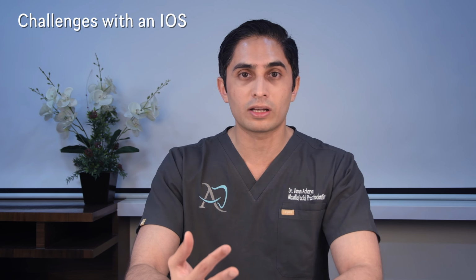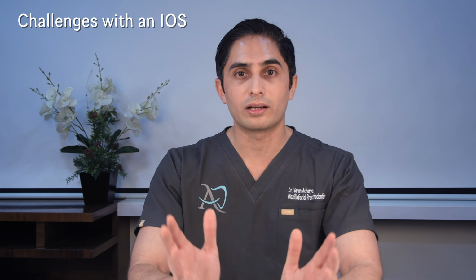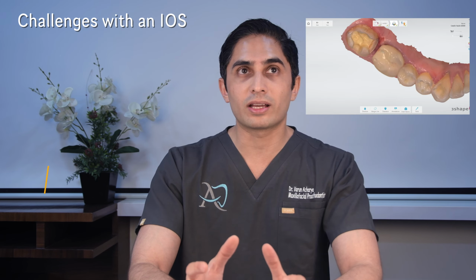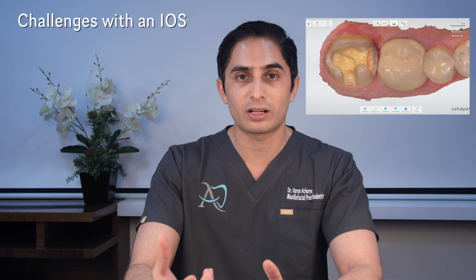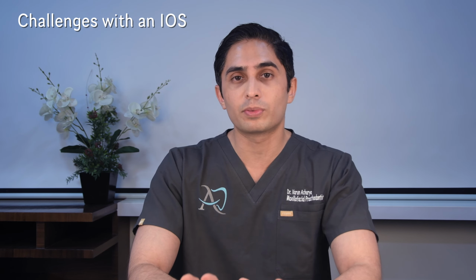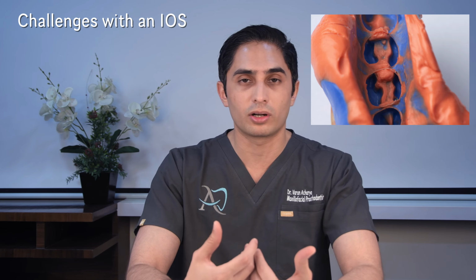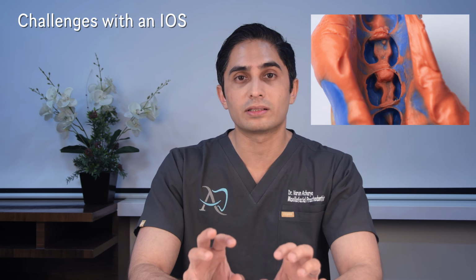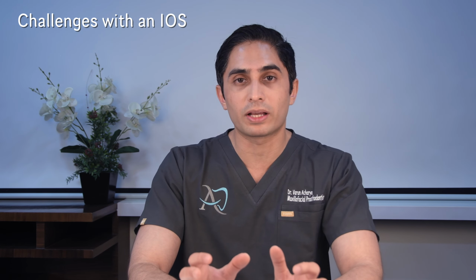Now, inlays and onlays in the traditional sense with the diverging walls, they are, I would say, complex geometry. They are a little bit difficult to scan, but once you scan them, the design also becomes a little bit challenging. We have found much more success with a simple analog method of taking a simple impression with putty wash or polyether or whatever you want to do to capture those preparations of your inlays and onlays with complex geometry. We have not found great success with scanning.